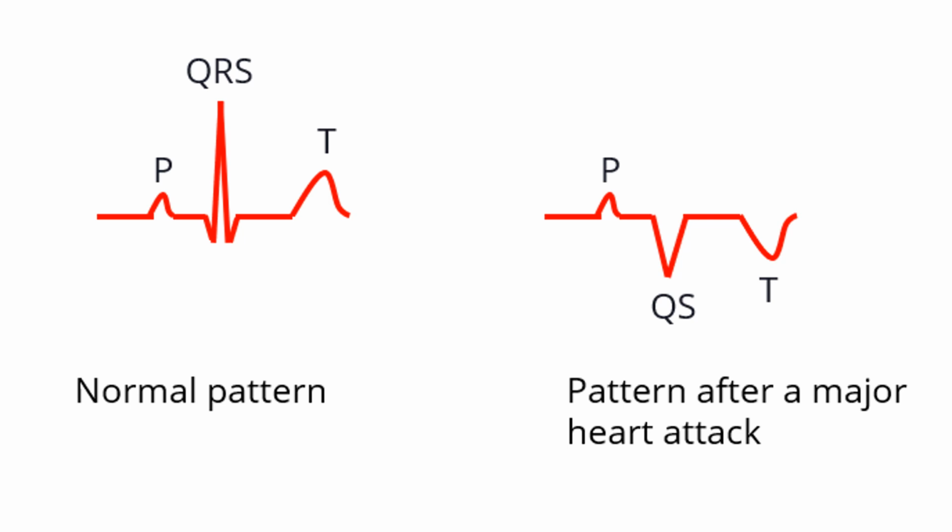Abnormalities in the pathways of conduction of electrical signals and blockage of the signals in these pathways all have their own signatures on the ECG. Even abnormalities in the electrolytes in the blood like low potassium levels, high potassium levels, low calcium levels, etc. manifest as abnormalities in the electrocardiogram as well because of their effects on the genesis and conduction of electrical signals of the heart.